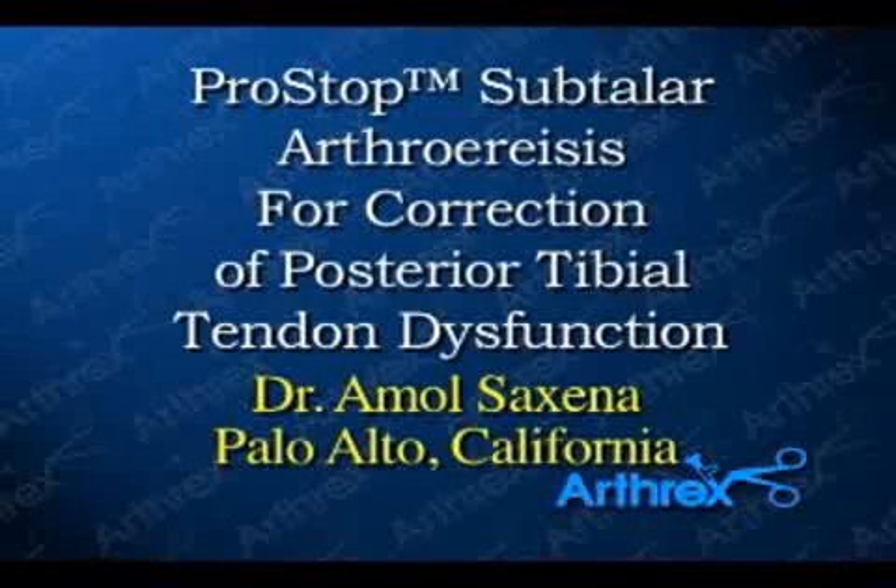The following procedure is performed by Dr. Amol Saxena in Palo Alto, California. The patient is placed supine. If needed, a bump can be placed underneath the ipsilateral hip.